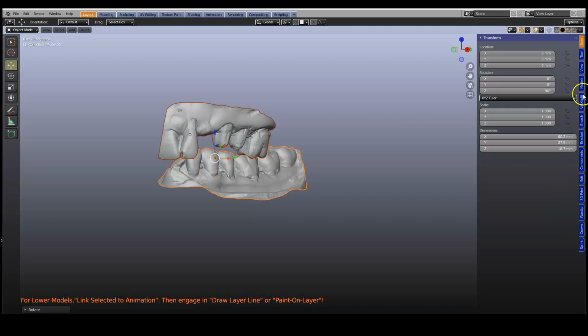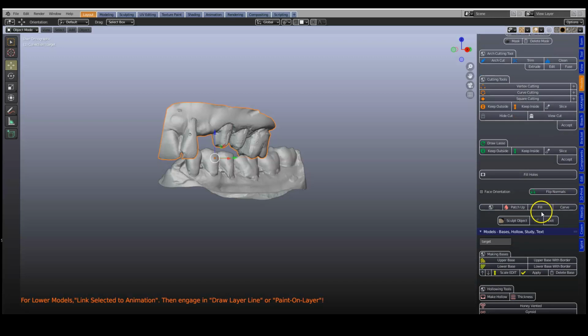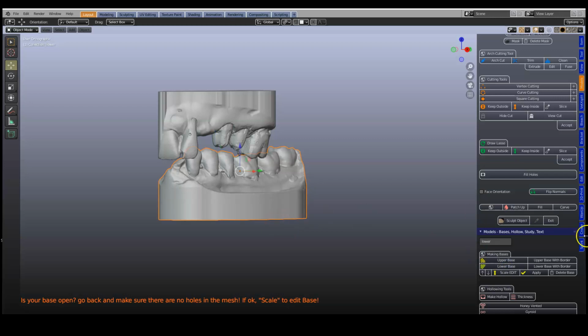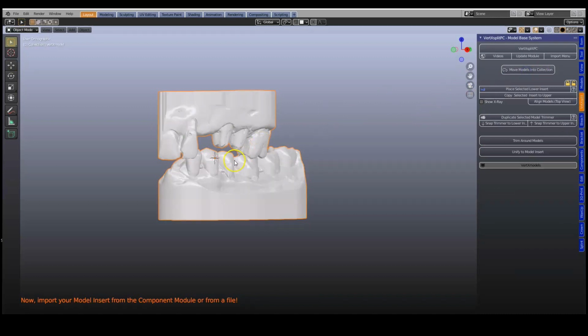Model designer. We're going to create a model. So upper base and lower base. Excellent. Lower base. Perfect. Let's go to the VertXsplit here. This one and this one. And we're going to move those into the collection.